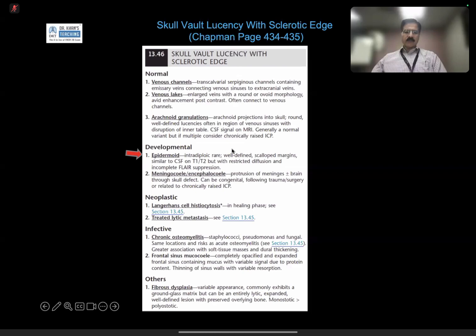Clinically speaking, if you would have gone into this territory, I would have said that no, there is no history of metastasis. Of course, clinically it was a completely incidentaloma. It was not at all, what we call, bone pain, etc. This example also tells you that at a very simple case, how difficult it becomes for differential diagnosis in the exam.